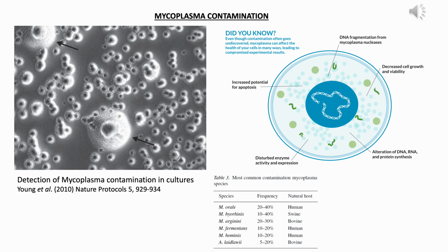So this is very wrong in science. One has to understand why what you have established earlier is no longer working, and probably one of the reasons for this change can also be Mycoplasma contamination. Mycoplasma may not kill your cultures completely. The cells may be growing, but they change the metabolism of the cells. So there will be altered expression of various enzymes and proteins. In fact, the cell cycle will be altered.